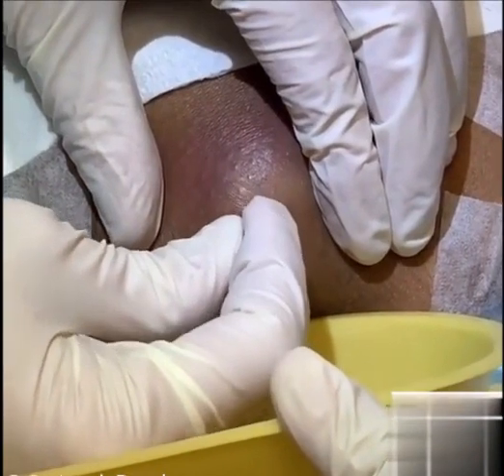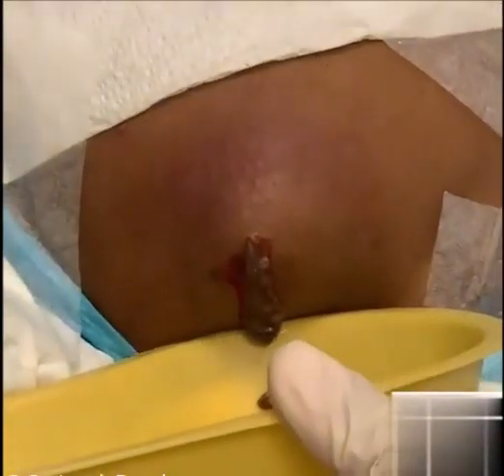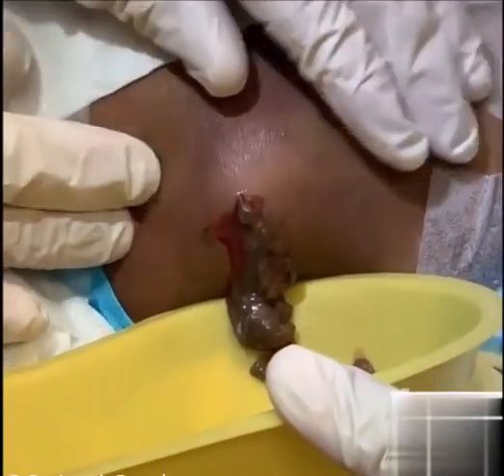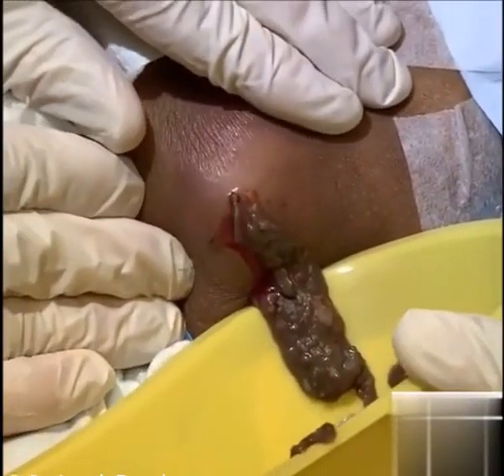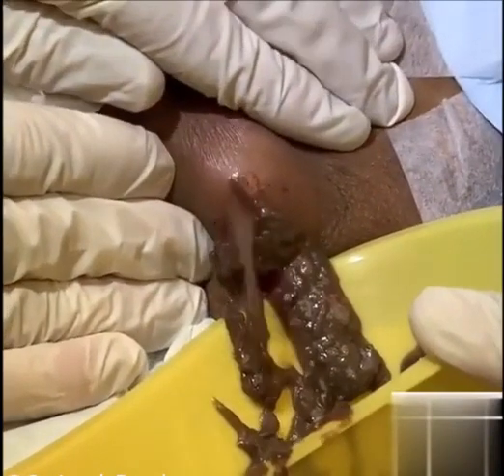Good job, one more, just a little bit — there we go. This definitely looks like it was probably not too bad pain-wise, which is good for sure. Doing okay? Yeah, good. Just a little pressure — let me know if it's too much, okay?